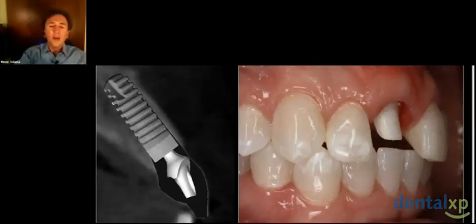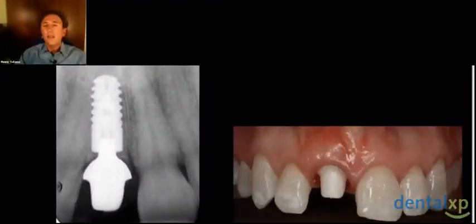Again, notice our goals, which is maintaining the thickness of the tissue, developing the area optimally, and following the contours that will eventually be part of the restoration. All of this can be treatment planned virtually and delivered in a very efficient manner. Critical to all this, really, in the end, is the interface. Integrity and the position of the soft tissue.